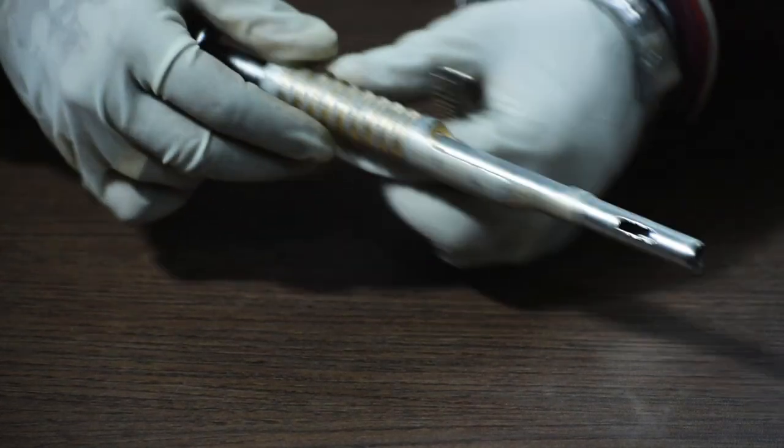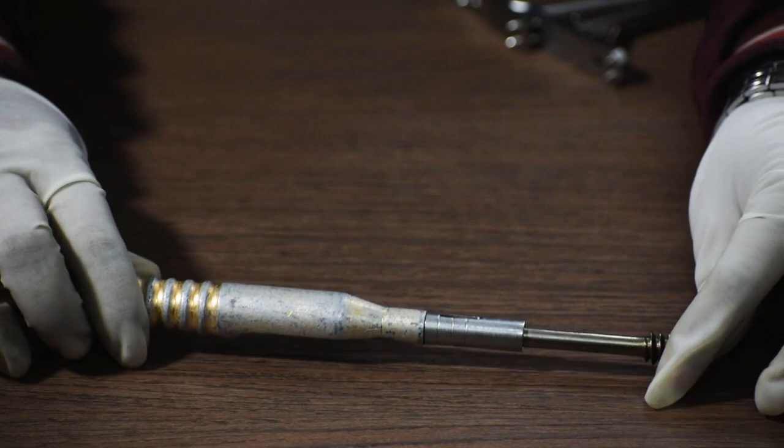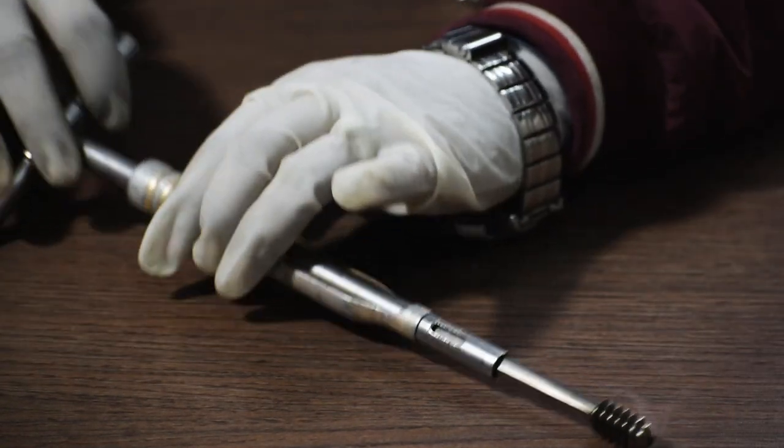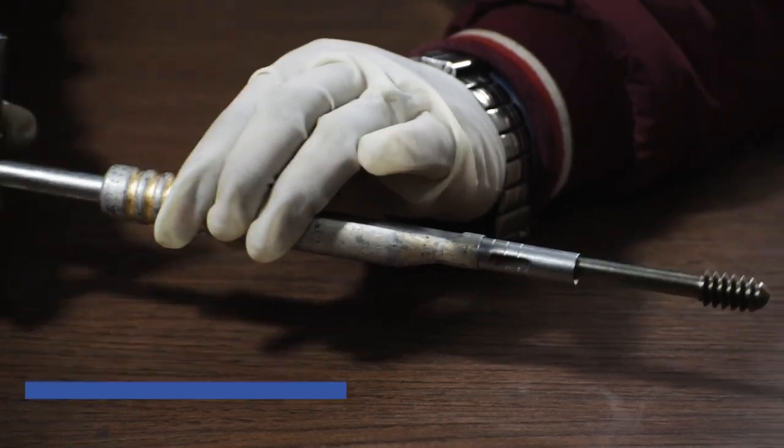After tapping, we will use a T Handle with guide shaft and the long centering sleeve to fix the lag screw in the fracture side. And then we remove the T Handle attachment.